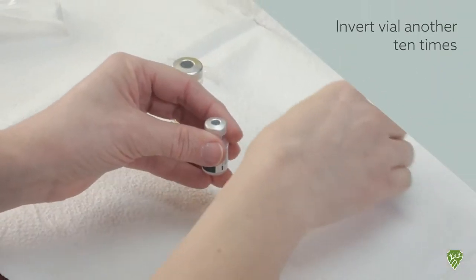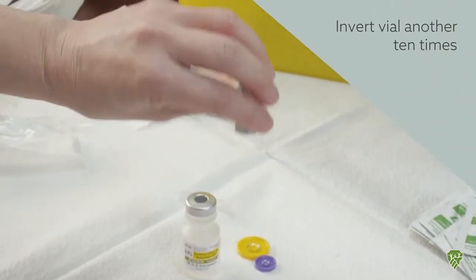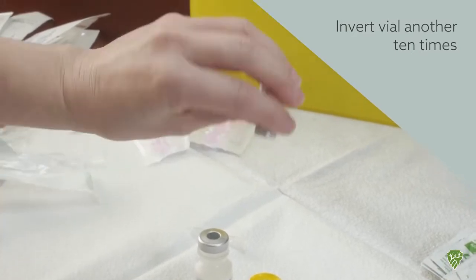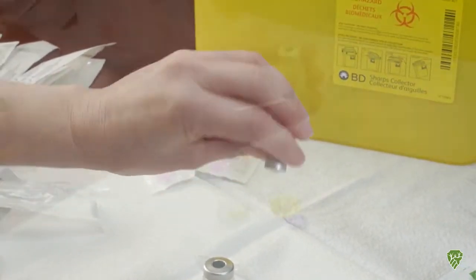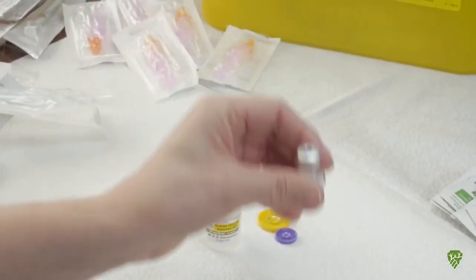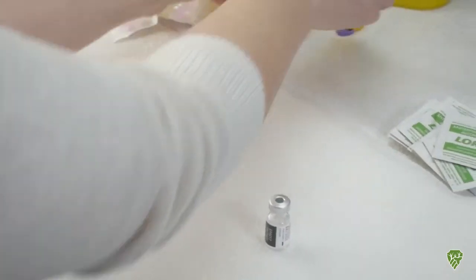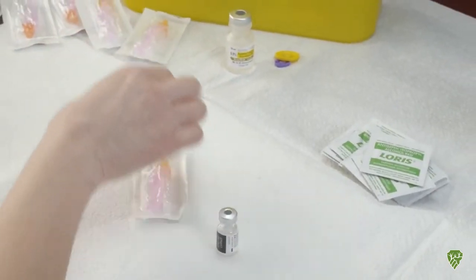Now the vial needs to be inverted another 10 times. Now I'm ready to prepare the supplies to draw out the doses from the vaccine.